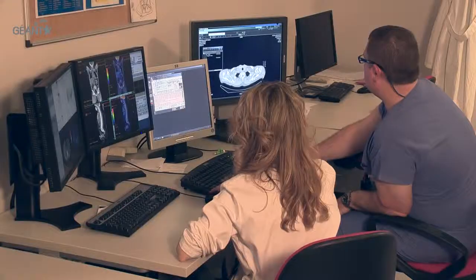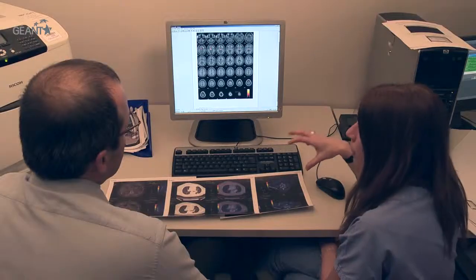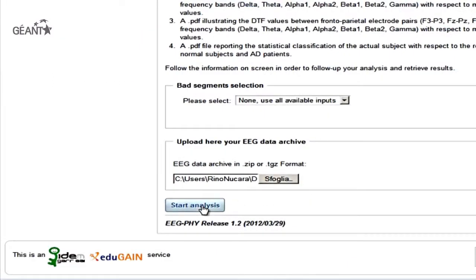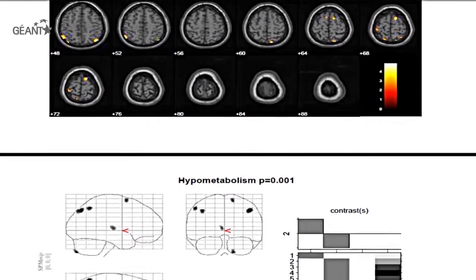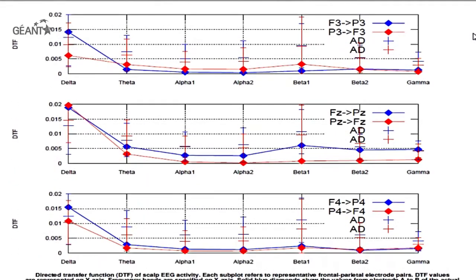To obtain this information, patient images need to be compared to normal subject reference images from many databases in research centres across Europe. The DECIDE project was created to overcome problems that clinicians have in accessing normal subject databases in order to compare the patient studies. The DECIDE infrastructure puts together different resources, in terms of computational resources and normal subject reference images, and sophisticated complex algorithms are performed and provide new biomarkers for the disease.